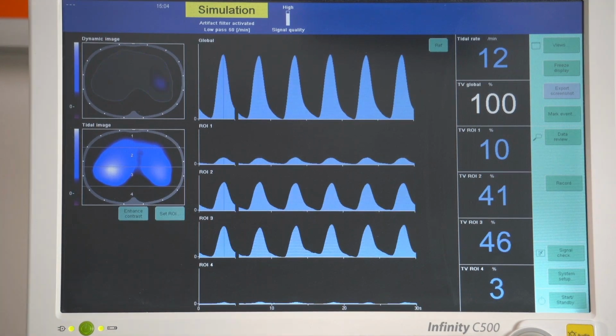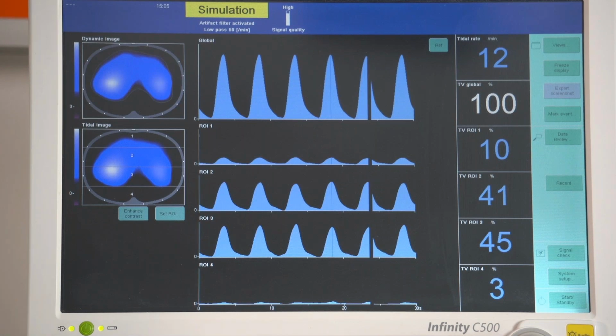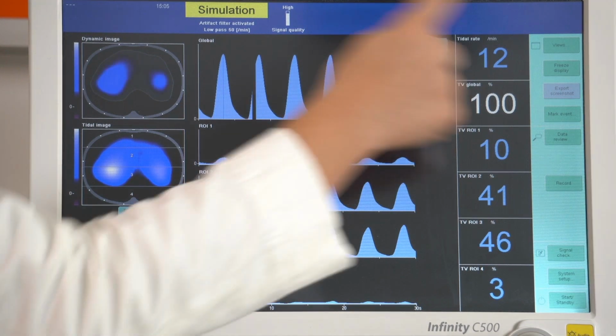So what we can potentially conclude from this, when we connect PulmoVista to the patient, is that potentially we have a patient with atelectasis. So we have de-recruited areas of the lung. As a result, we would try to perform a recruitment maneuver. So now in the simulation file, we will soon start with the recruitment. So this is our main view.